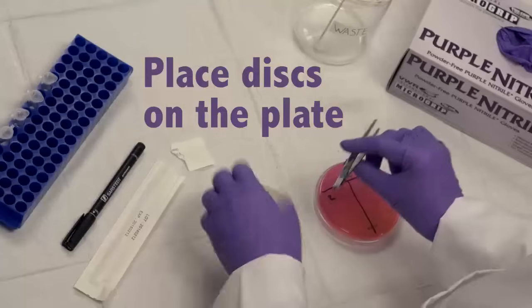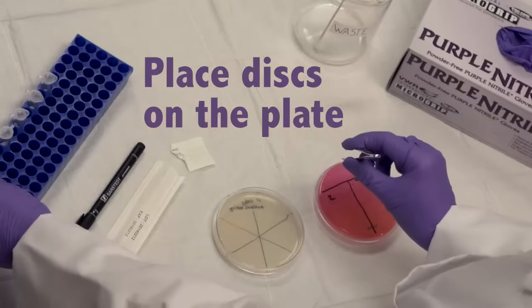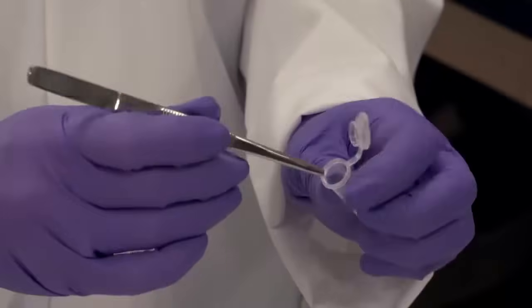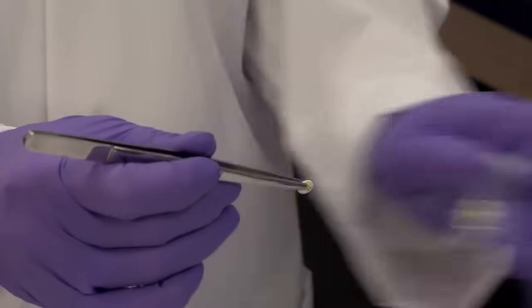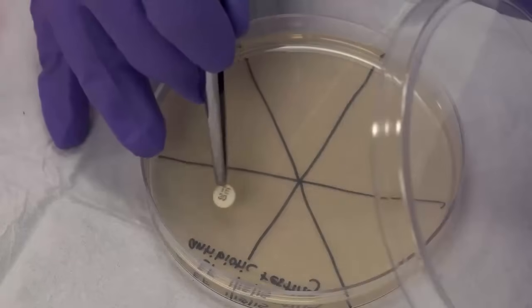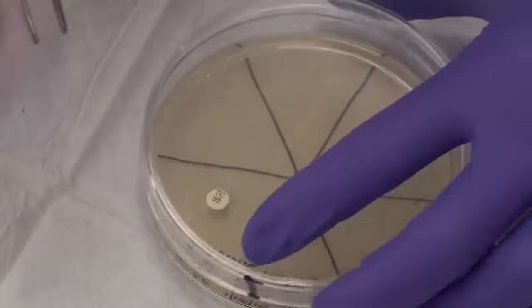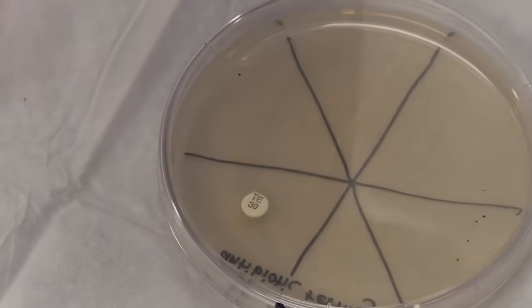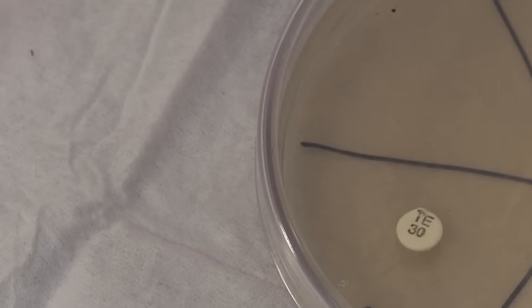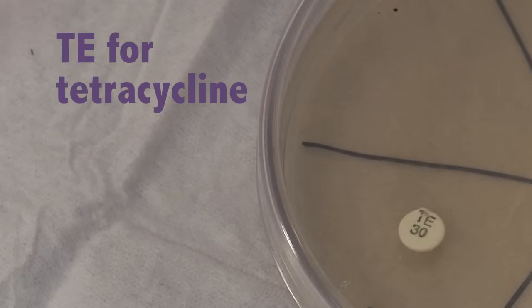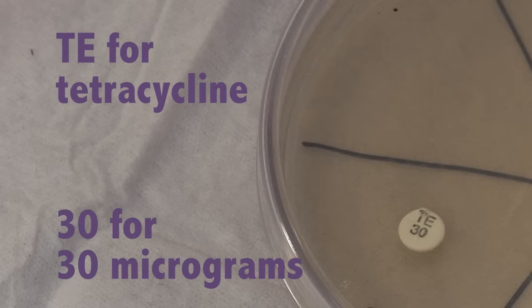Use the tweezers to get one antibiotic disc and place it in its own section of the plate. Gently tap the disc to stick it to the agar. The letters TE are an abbreviation of the antibiotic's full name. In this case, TE stands for tetracycline. And the numbers tell us the concentration of the antibiotic on the disc, 30 for 30 micrograms.